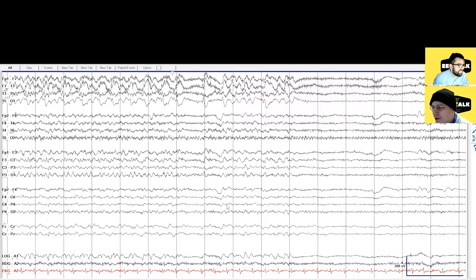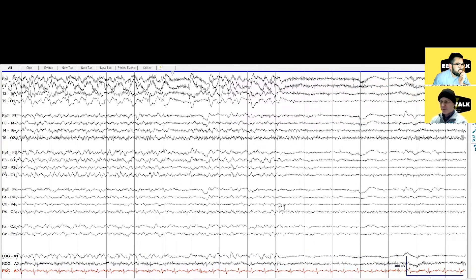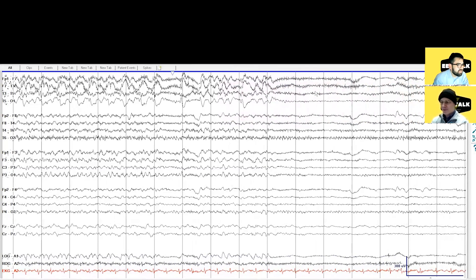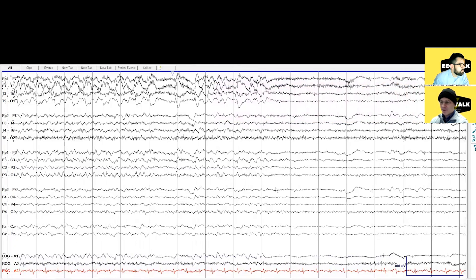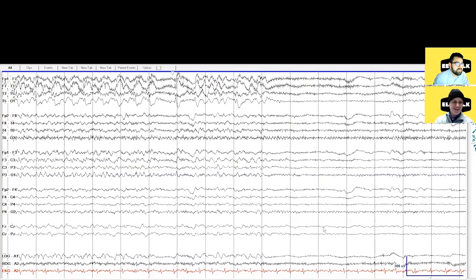Look at this — talking about evolution, what do you see here at the end of this seizure? Something pretty interesting. The suppression of activity? Well, right — but right before that, what happened to the rhythmic activity? It slows down. So if you were to hear this EEG, seeing the whole seizure, what would it sound like?